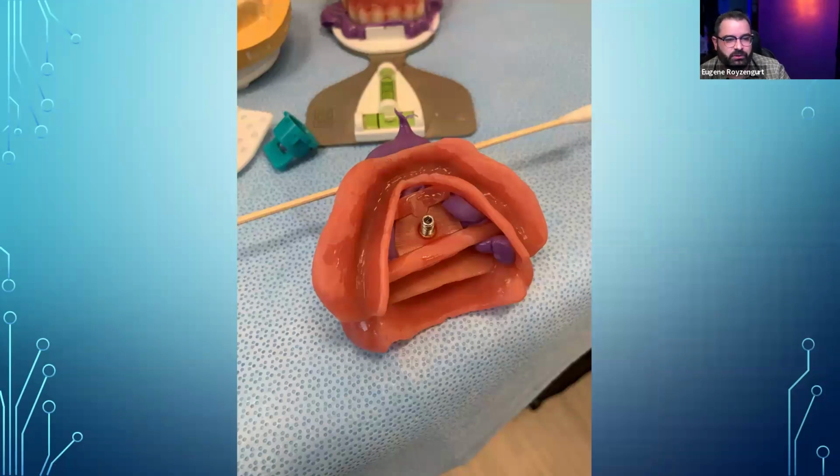What I will basically do is have wax rims also, at least the maxillary one, and I'll mount my maxillary on first, and then I'll use my tracer to mount my mandibular to my maxillary, and then you go forward. So that's pretty much it for today, guys. We have about 5 minutes left, and I'm probably going to use this time to answer some questions if you guys have some, and we'll go from there.